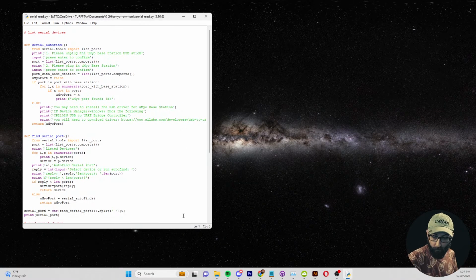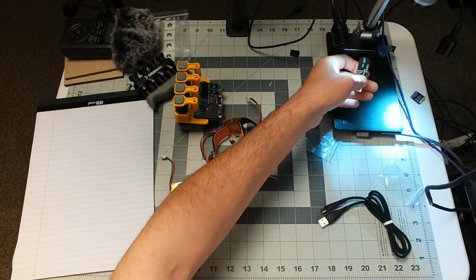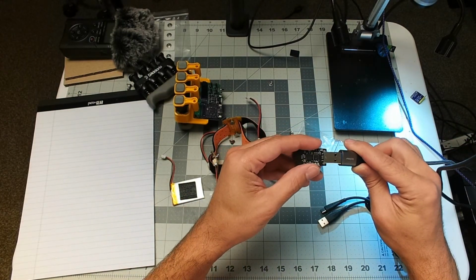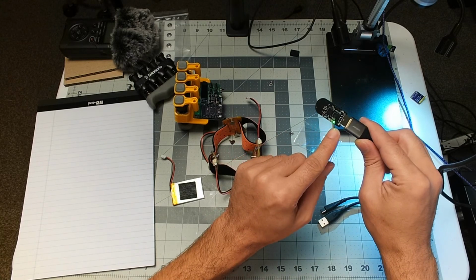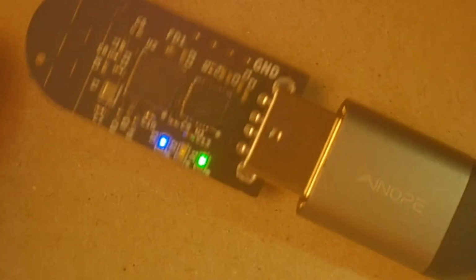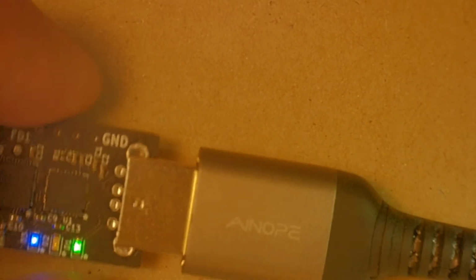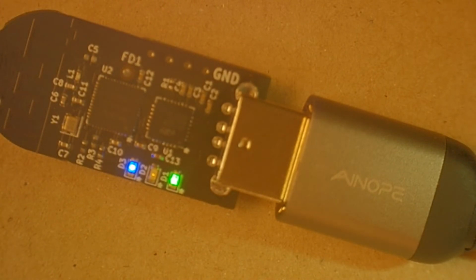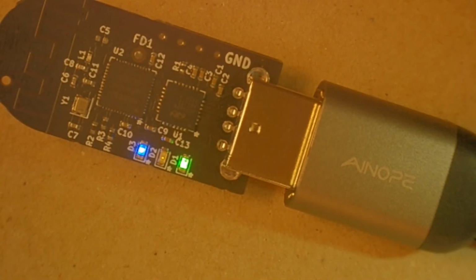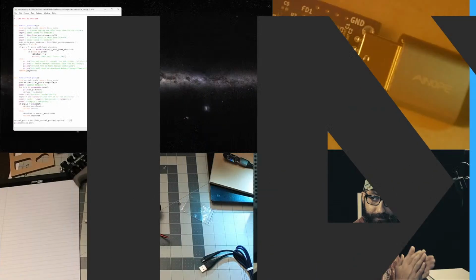So first off, we are going to do some basics. We're going to get the base station plugged in. And we see that it does light up green and blue. And I will put this in the, so you can see it here. I'm going to use a piece of cardboard, so I think there's a metal backing of this. Use my cell phone as a cable holder. That works. Okay, so D1, D3 are lit. I don't think that will change too terribly much. My phone is going to fall off the desk here. Okay.